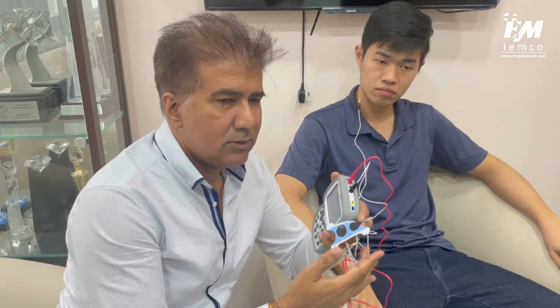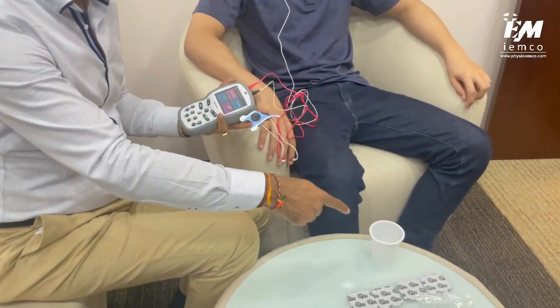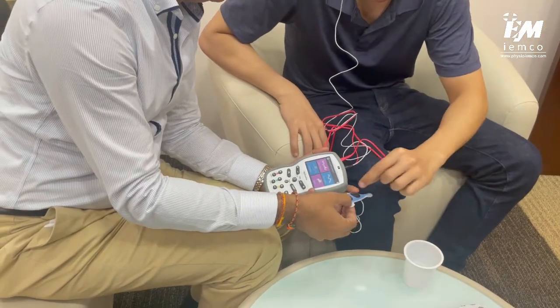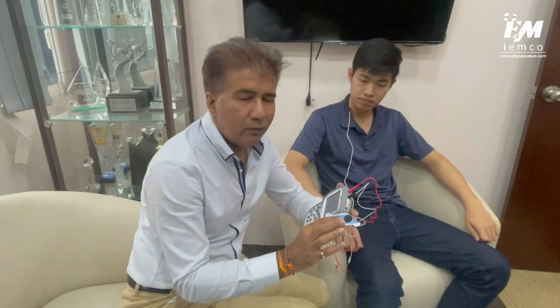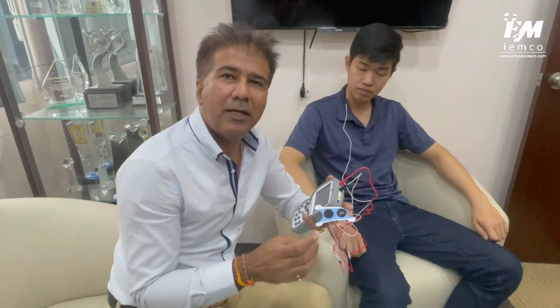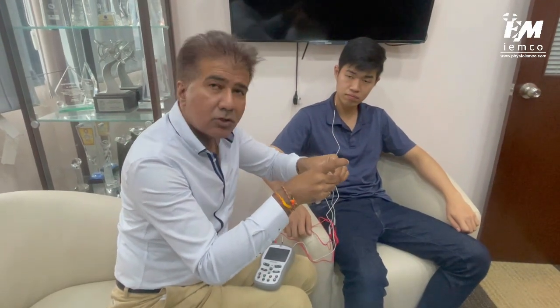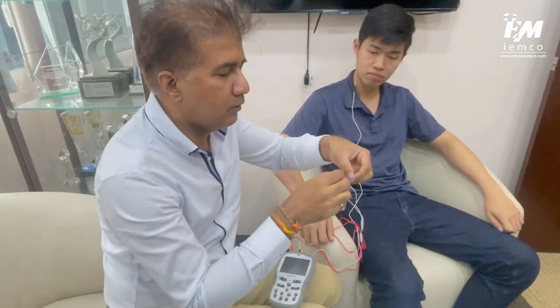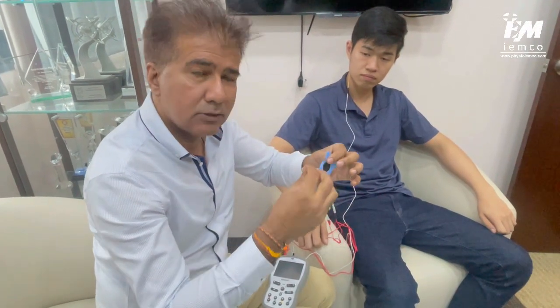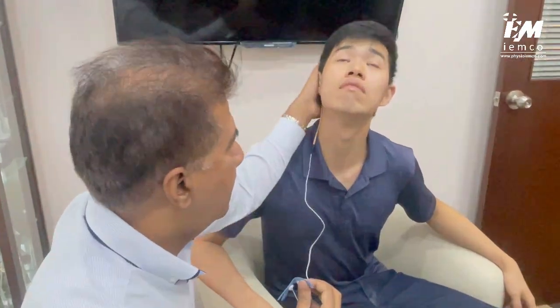It's good to put a little drop of water onto the electrode — JJ, can you put a drop of water here? Once you have the water, I always like to rub it in to help activate the gel. Once the electrode is ready, we peel off the paper strips so the electrode can stick well to the skin surface. Come forward JJ — relax a little bit. Okay, swallow.